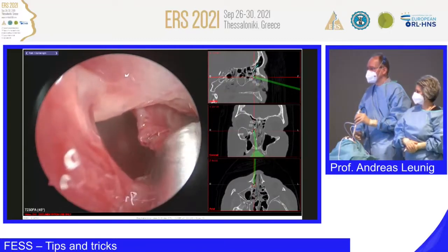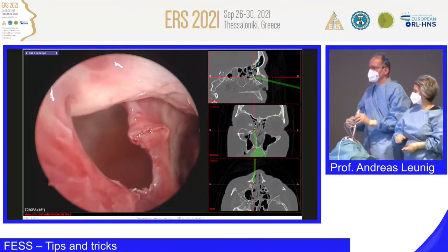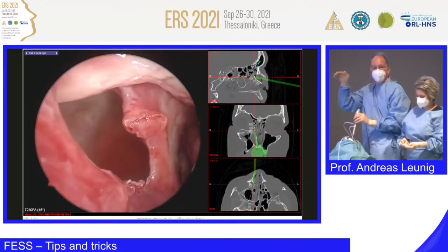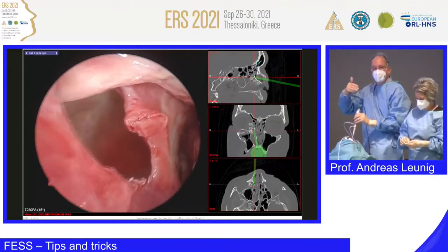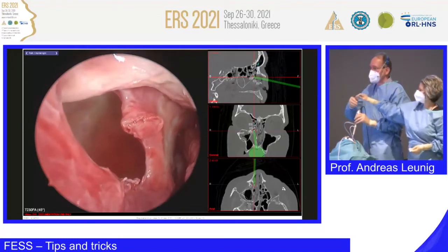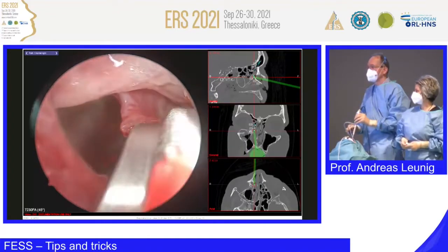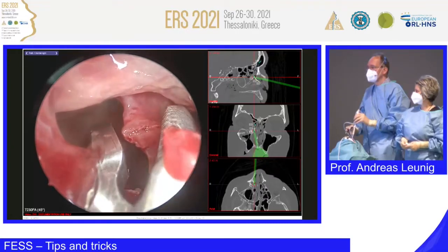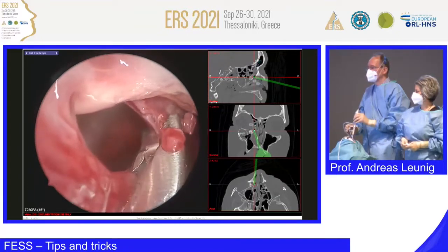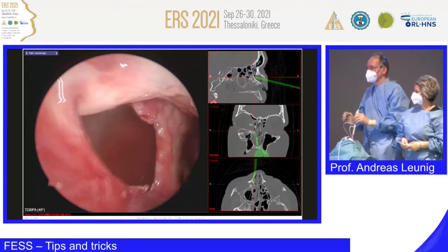And now I stopped opening the natural maxillary sinus ostium anteriorly, because there's no reason, but it's not at all a problem to enlarge it posteriorly in case there's an indication. Then the through-cutting Blakesley, please. And I like especially this instrument. It's a through-cutting instrument. You can cut, and you nibble away some of the structures, or especially when you want to make a wide opening, the knife-blade scissors, please.